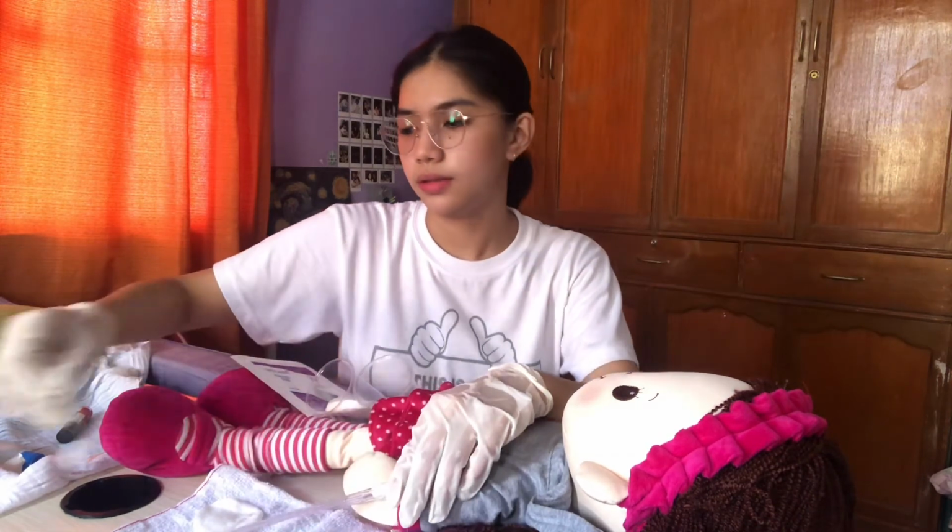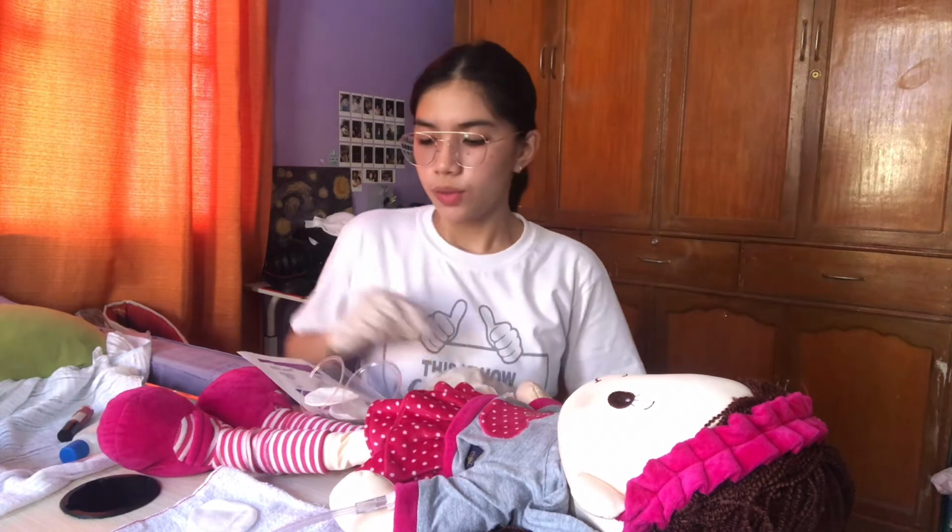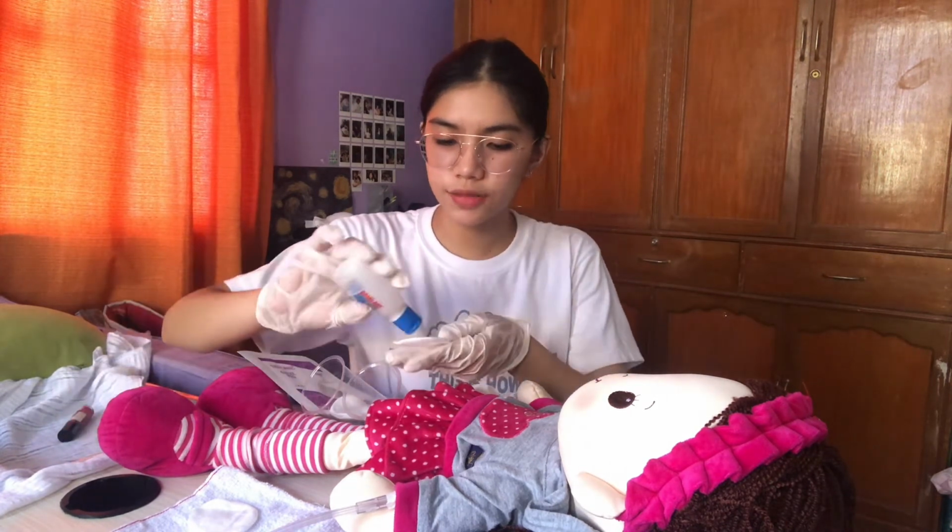Remove the tape securing the needle or catheter. Okay, ma'am, remove ko na po. So, when removing this tape, stabilize the needle or catheter with your one hand. Clean the IV site. We will start with adhesive remover to remove the adhesive residue.